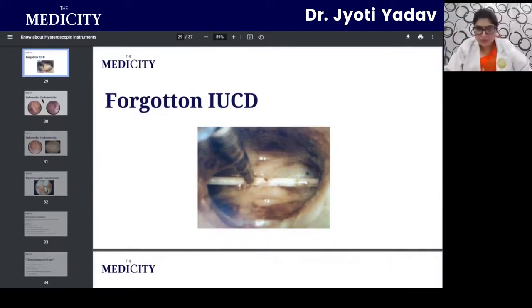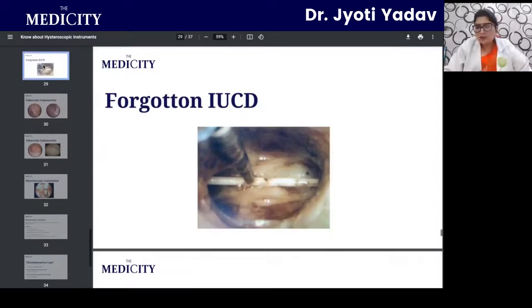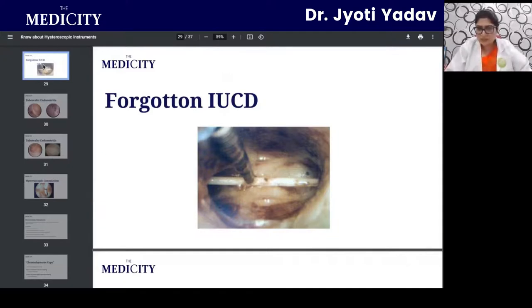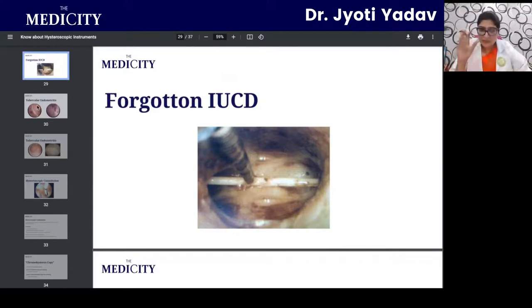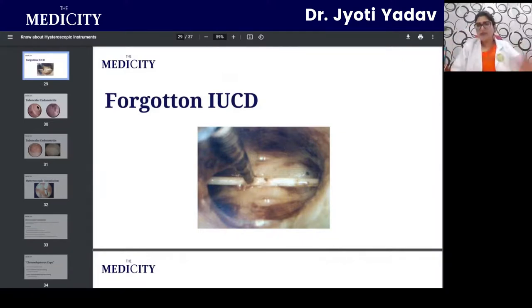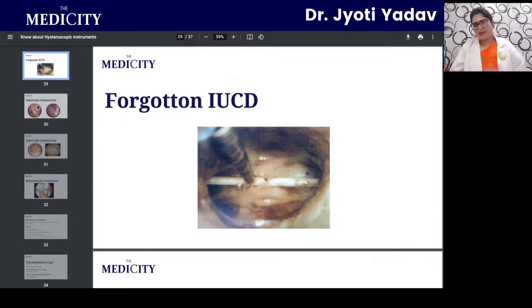A significant number of patients present with a lost IUD thread — the device is strangulated or entangled somewhere in the uterine cavity. When it cannot be found on direct examination, a hysteroscope is introduced and the multiload IUD is retrieved under direct vision.